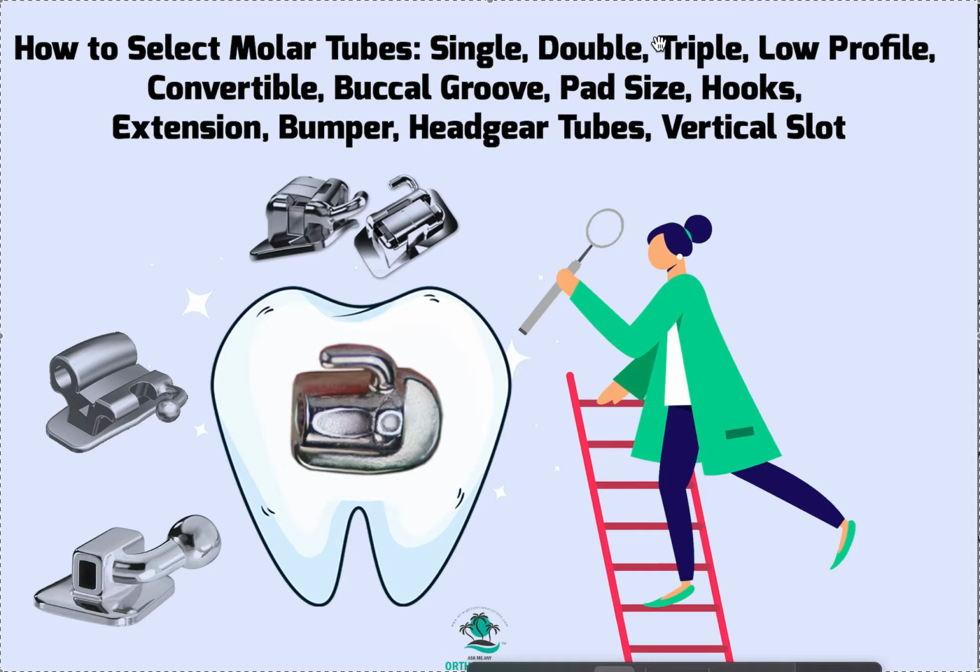And you guys are just going to be using singles. You're definitely not using triples. That's absolutely ridiculous. But let's say we didn't have a HeadGear tube. If we had a triple, it'd be a HeadGear tube, a slot, and a slot below it. We would run the auxiliary cantilever to upright a second molar or an impacted canine off the auxiliary tube, or the triple tube or the double tube. Anyways, that's TMI. You don't need to know that.